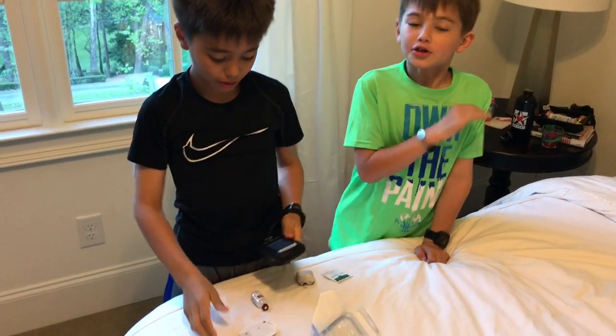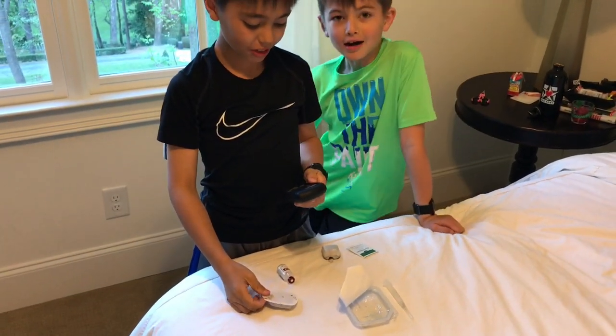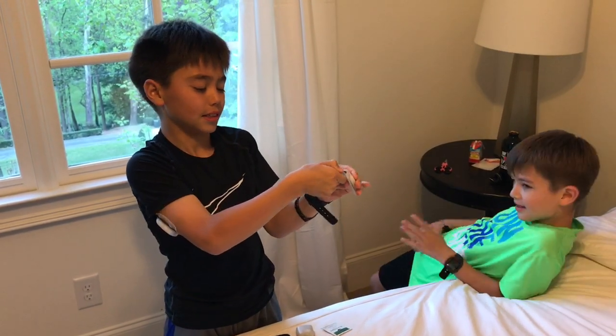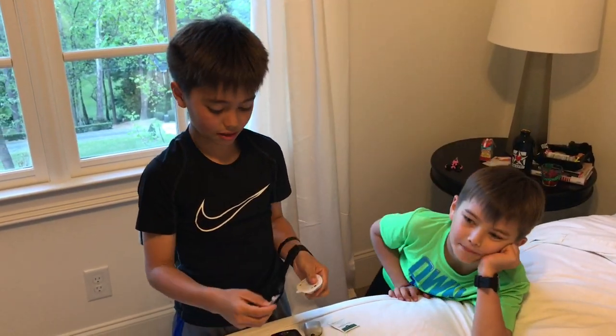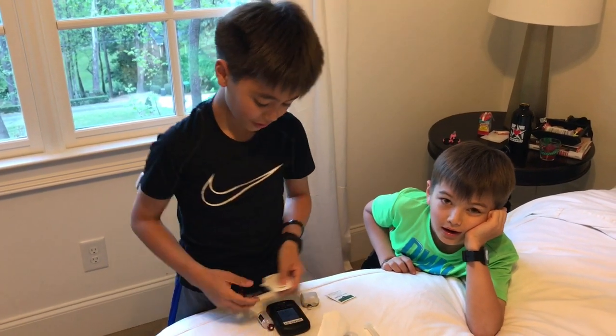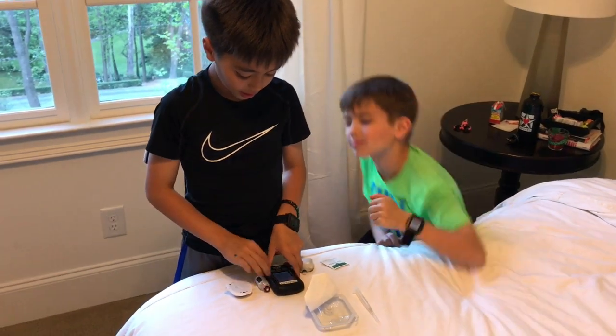Now it says prepare infusion set. Remove the pod's needle cap. Remove this — don't be afraid to pull hard, it's hard to come off. Hit next.